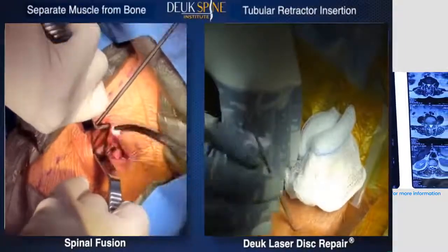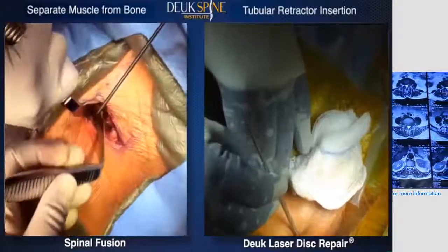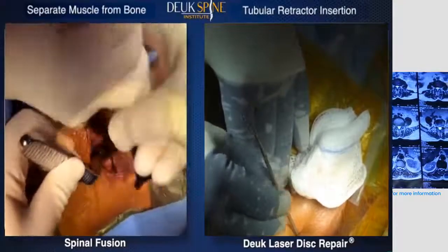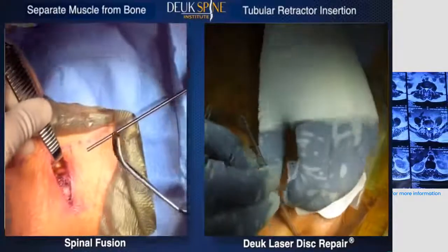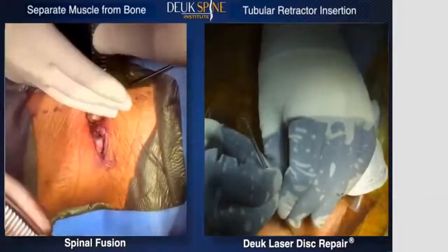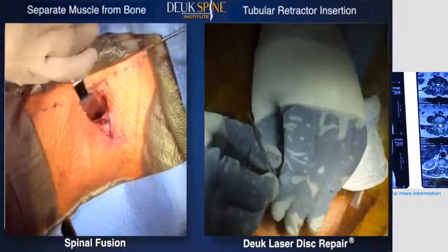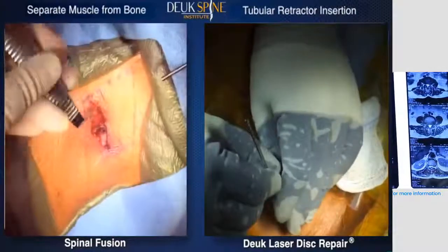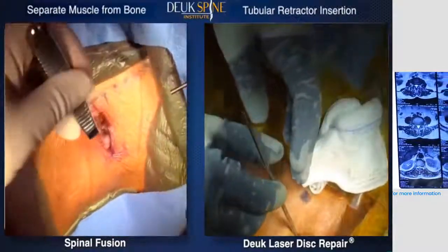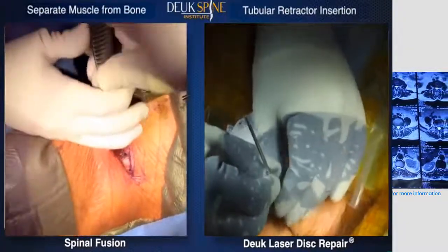In this small opening, a cylindrical rod, called a dilator, is inserted to gently spread the muscle to create a small passage and guide through which the surgery is performed endoscopically. The incision for the fusion continues, including penetrating the skin, fat tissue, and multiple layers of muscle through to the bone.